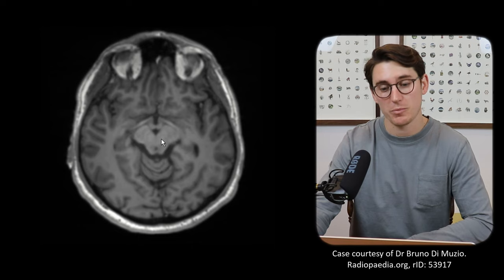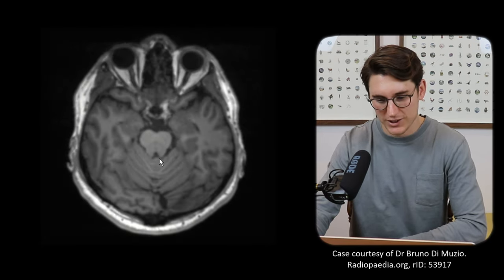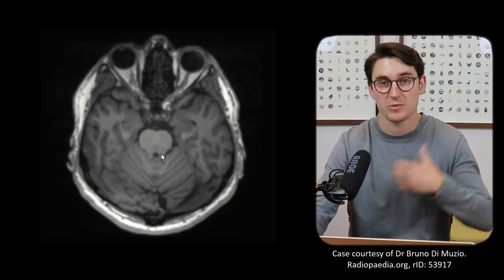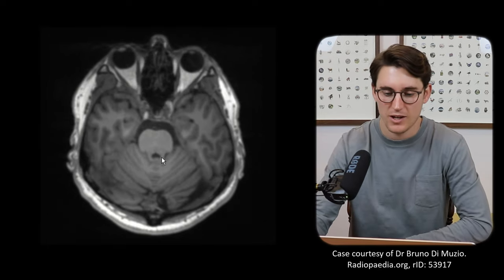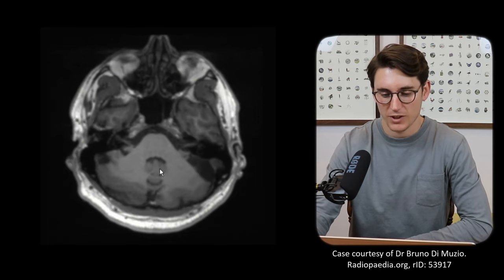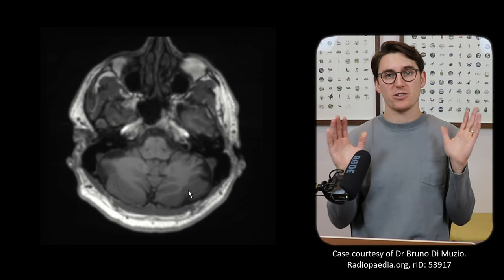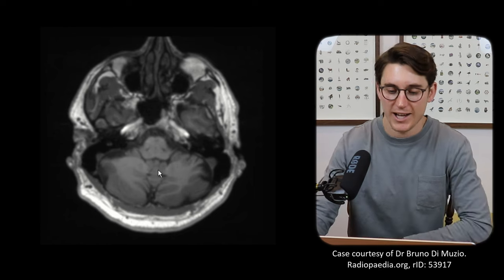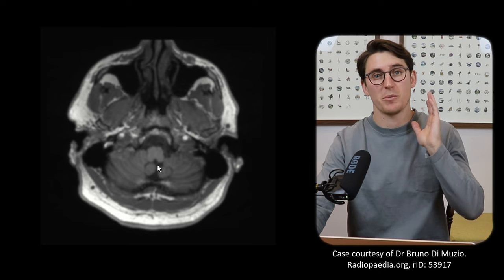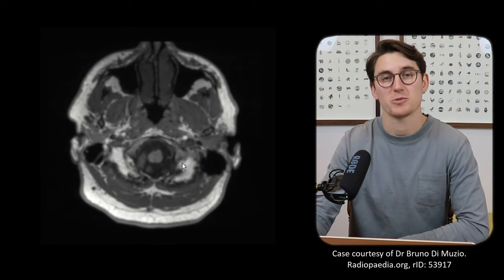We're now getting into the level of the midbrain. That cerebral aqueduct will head down, and posteriorly we have our cerebellum. We have our inferior portion of our midbrain, transitioning now to pons. We can see our fourth ventricle here between the pons and the cerebellum, coming down. We see our lateral apertures — otherwise known as the foramina of Luschka. Then as we head further down we see our medial aperture — also known as the foramen of Magendie. And we are also continuous with our central canal of our spinal cord.